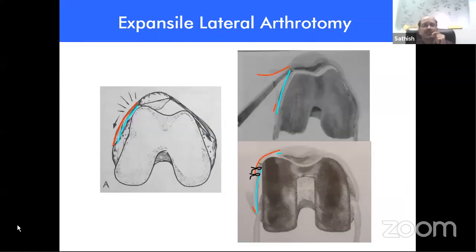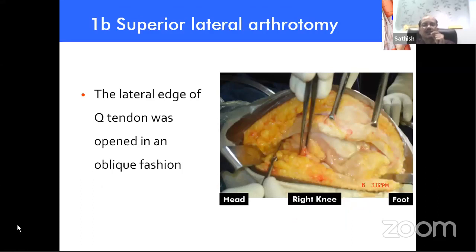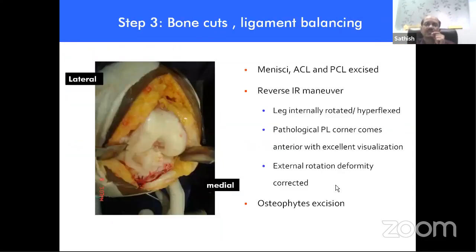So this is the pictorial representation of that. The dissection has to be superiorly extended along the lateral edge of the quadriceps tendon. And inferiorly, the iliotibial band is released, and the capsule which is adherent to the osteophytes is all released. So this lateral flap will have all the structures. The next step is to do a quadriceps snip. Generally, it is required in most of the cases. And then the patella is everted and the joint is exposed.